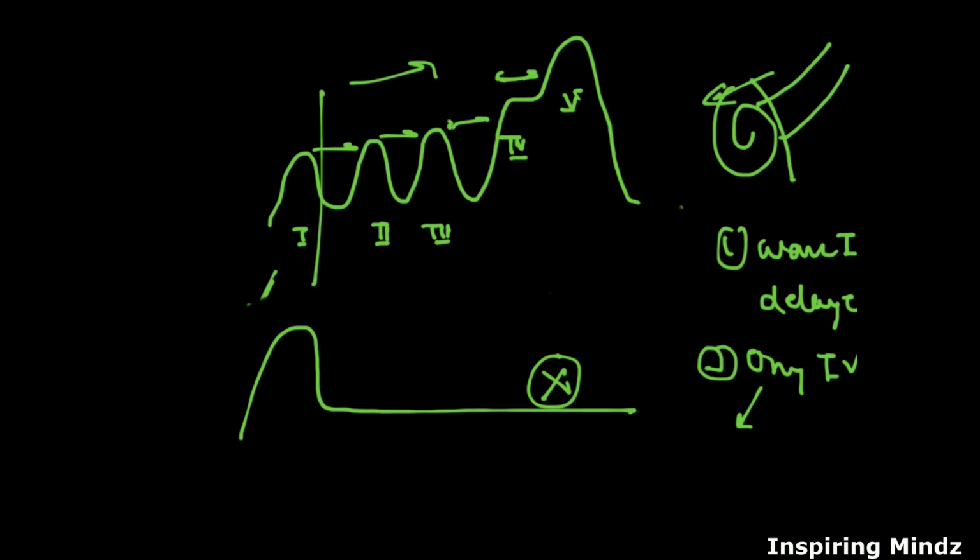If only wave 1 is present and all other waves are absent, it indicates pathology in the retrocochlear region. If wave 1 is present but the interwave latency is increased, that indicates some lesion between the distal cochlear nerve and the lateral lemniscus. So in one clinical condition, this is the most diagnostic test.